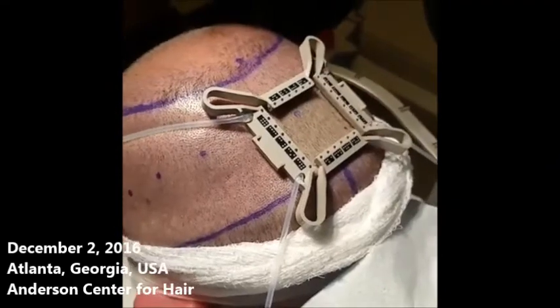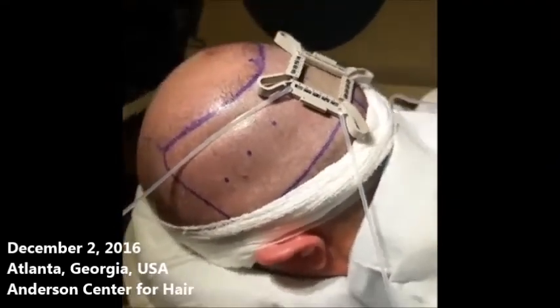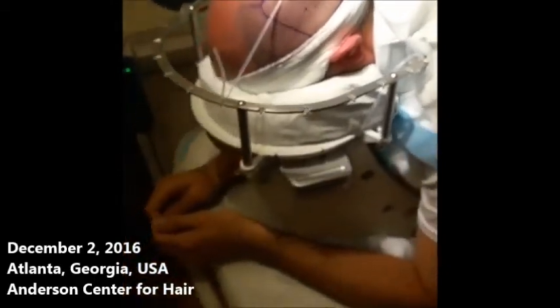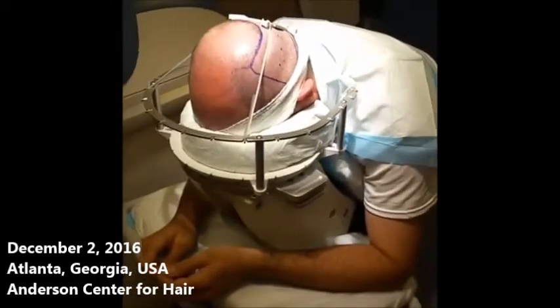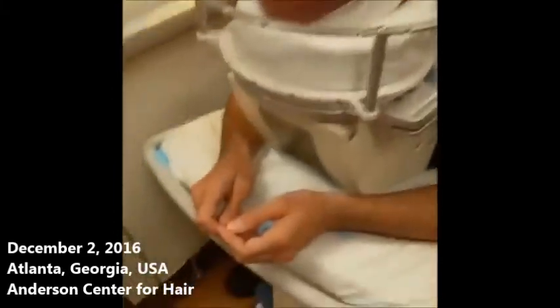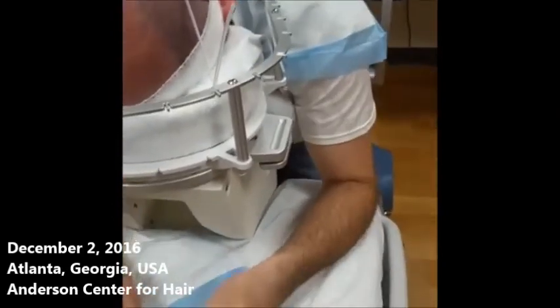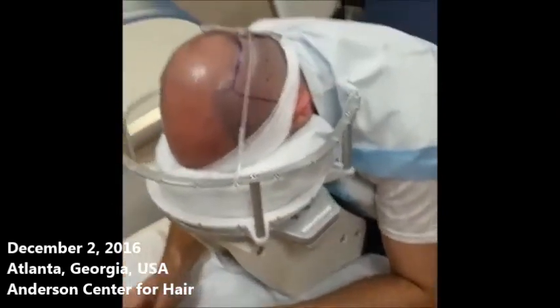James, does this hurt at all? Are you having any pain? Nope. Very good. James is awake but sedated, and in case his nose gets itchy, we've got a longer Q-tip so he can reach up under there and scratch his nose should he need to.